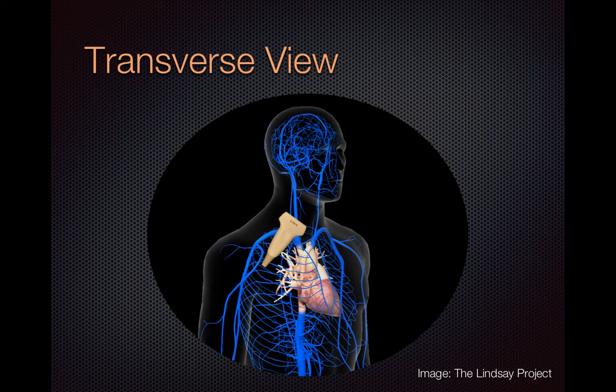To determine the height of the column, you'll image the internal jugular vein in 2 planes, transverse and longitudinal. Most people start by performing a transverse view of the vessel. Position your patient just as you would for a physical examination of the JVP, and then place your transducer in a transverse fashion on the right proximal neck just above the clavicle, with the probe marker facing to the patient's right.